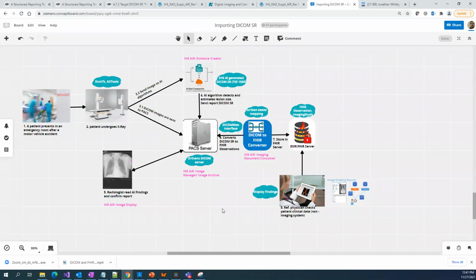The products will not be allowed to bid if they are not passing those IHE connectathons. Once you participate, they'll generate a report and publish that Siemens XYZ, for example, has passed this. That report is available and everybody will see that.